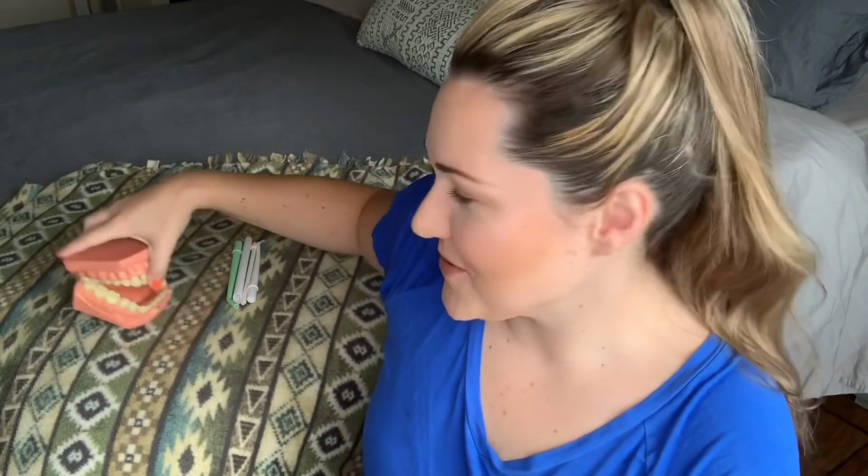But anywho, we're gonna do a video today about suctioning. Woo! So, I have all these different kinds of suctions that you will use as a dental assistant. And we're just gonna go over all of them, and just different placements inside the mouth that might help.